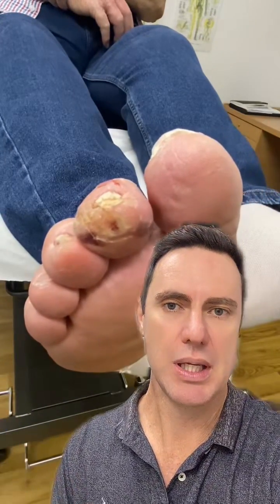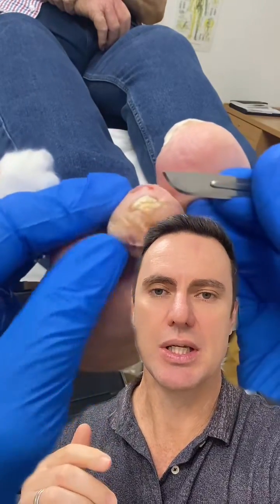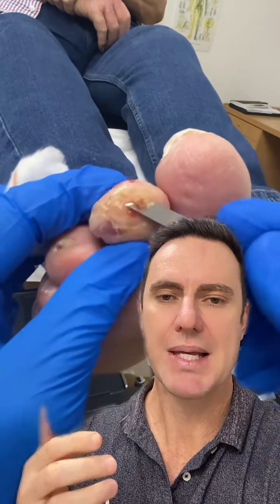The idea of what we're doing here is we need to remove all of this non-viable tissue — you can see there's quite a bit here. We remove it all down to the living tissue to give it a chance to actually heal. Because if we don't remove all of this, the corn will cause more pressure which basically damages the tissue beneath it and then it starts to break down.